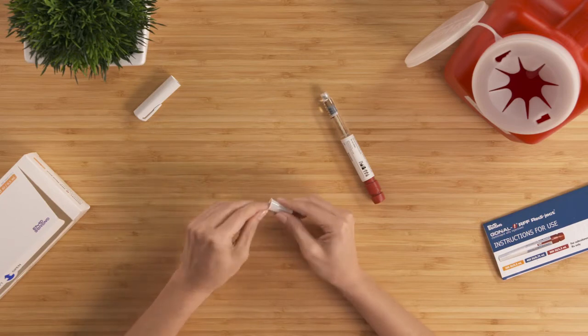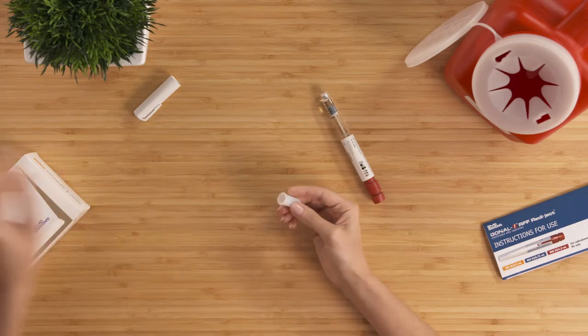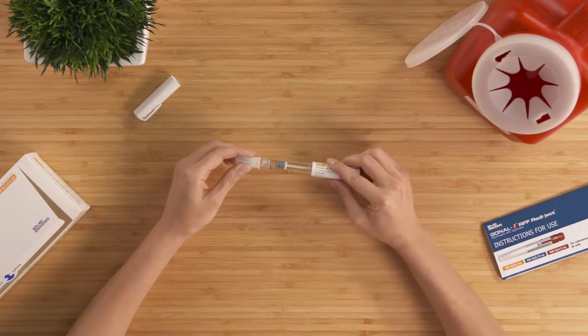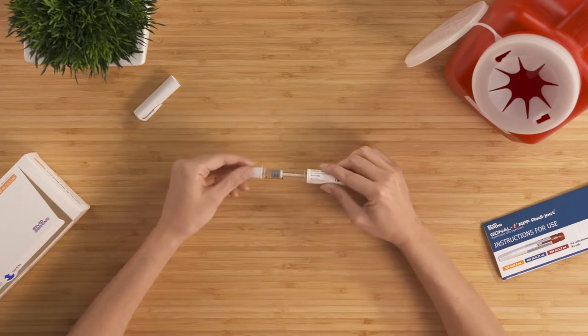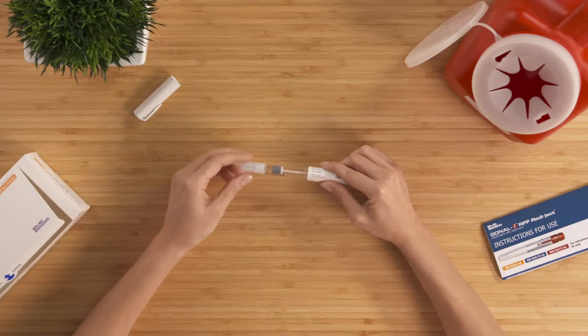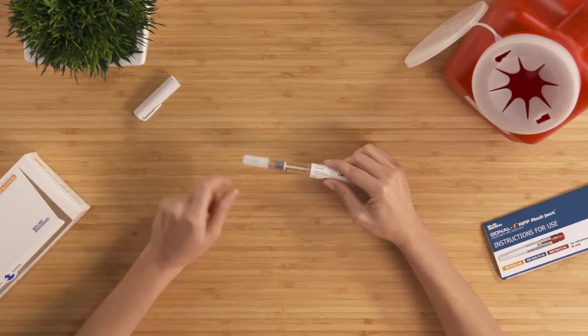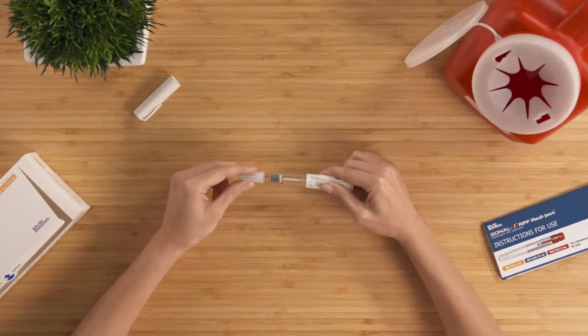Now, peel off the needle seal. Push the needle onto the clear plastic end of the pen, and twist the needle until you cannot twist it anymore. One point of caution. Don't attach the needle too tightly, otherwise the needle could be difficult to remove after the injection.